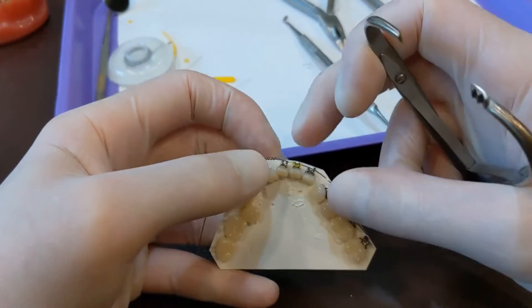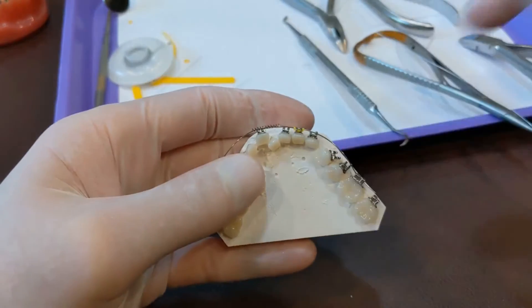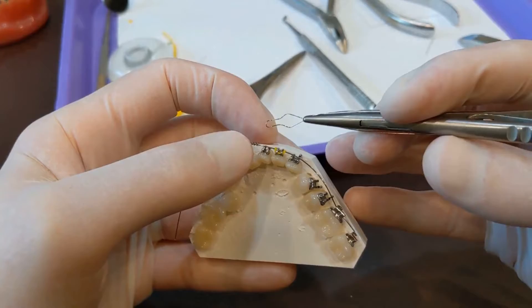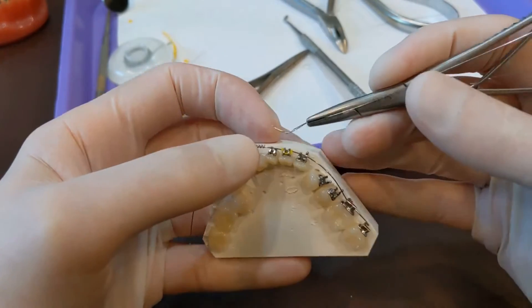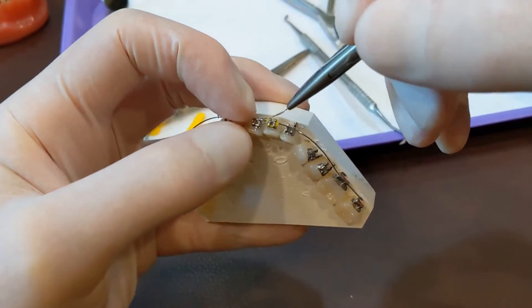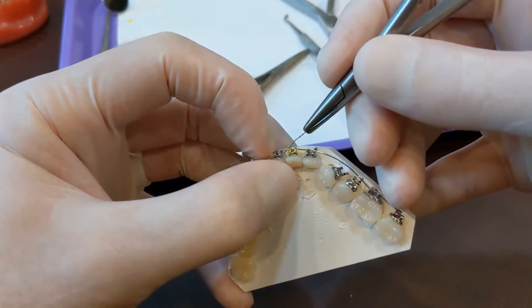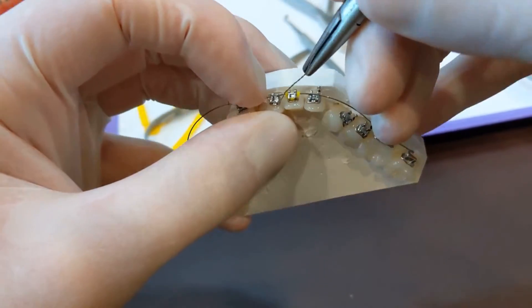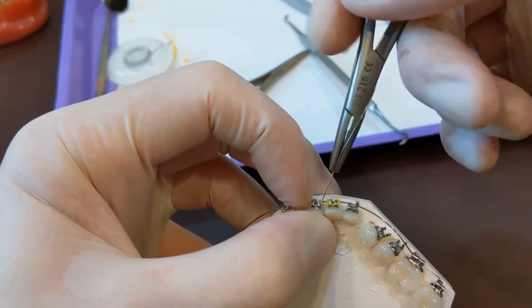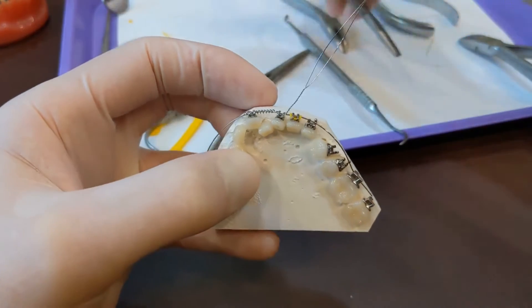You want a steel tie on either side of this open coil, because it's going to start to rotate those teeth and you don't want it to — so the steel tie will counteract that rotation and hold them nice and steady. Get your steel tie pre-bent like that, then slide it on nice and gently and get that cinched up good. When you put the steel tie on, you want it on there snug, but you don't want to lock it down too tight, or else the tooth can't slide over the wire. Just get it on there nicely, then clip the excess and tuck that down.